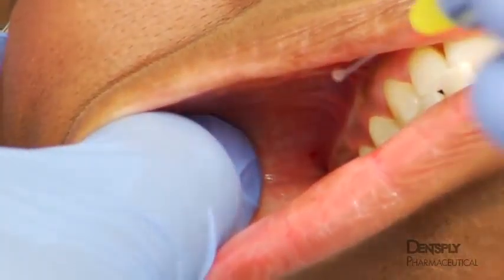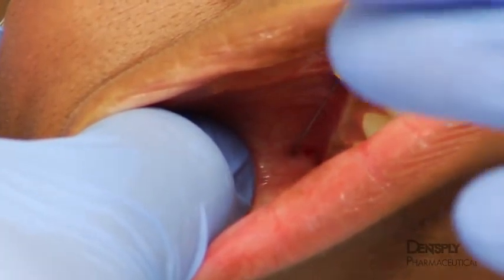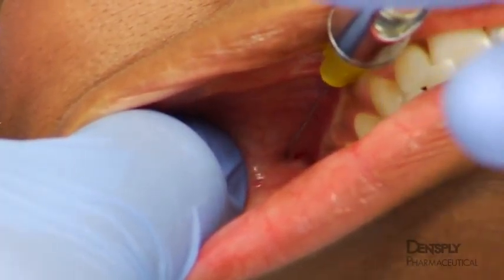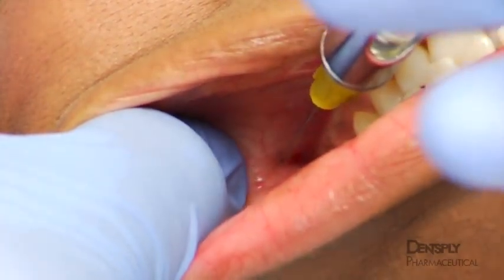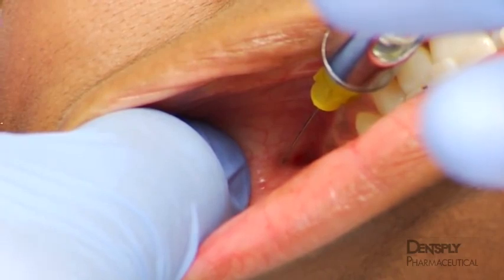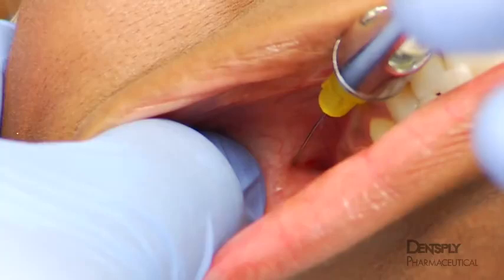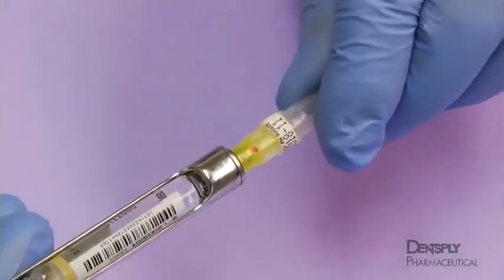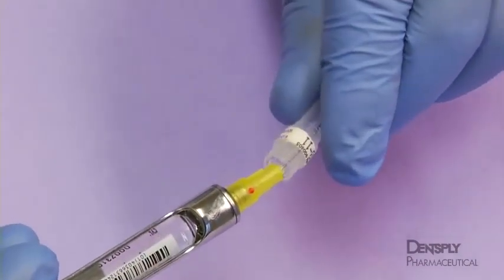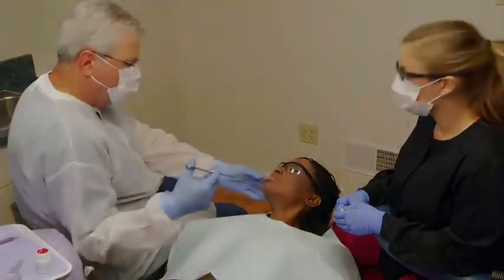The maxillary mucosa is sensitive to abrasion by the syringe, as it is advanced posteriorly. In response, the patient may move to avoid the stimulation, or the clinician may adjust the syringe to improve patient comfort. In either case, lateral rotation of the syringe automatically forces the needle medially. A possible answer to this problem is to bend the needle approximately 15 degrees at the hub. Then the syringe can be kept off the mucosa as the needle is advanced posteriorly.